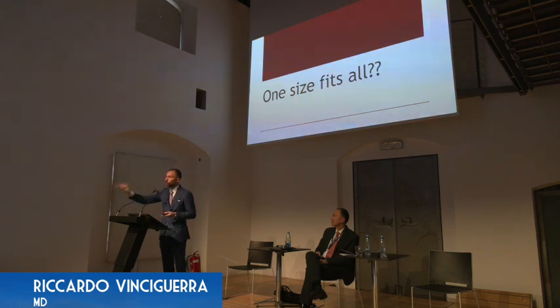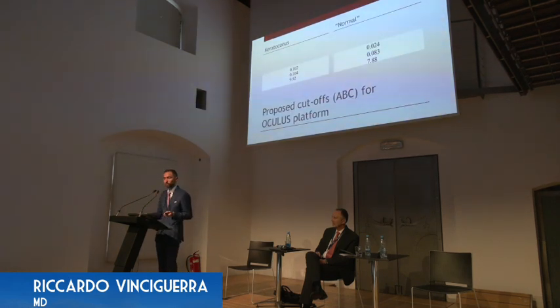Is it going to be more noisy compared to me? It's going to be more noisy. So it's the same thing for keratoconus. If you have an extreme keratoconus, it will be noisier.